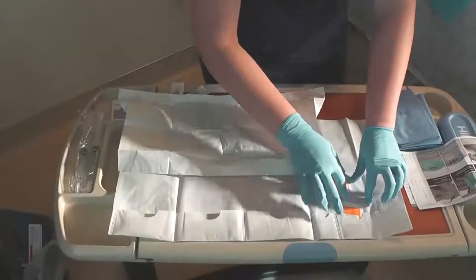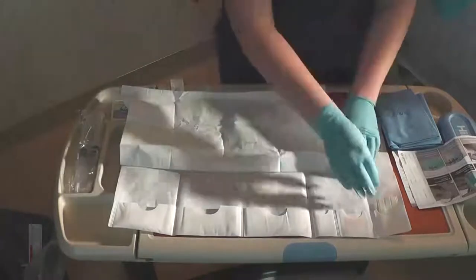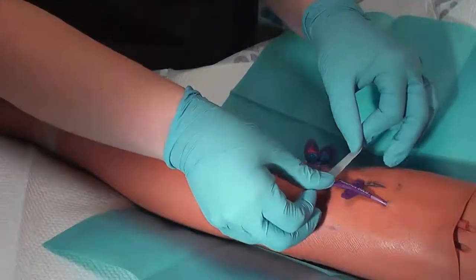There are three alcohol preps to assist in removing the existing dressing and statlock. Once those have been removed, apply the Steri-Strips at the wings to secure the line from migrating out.